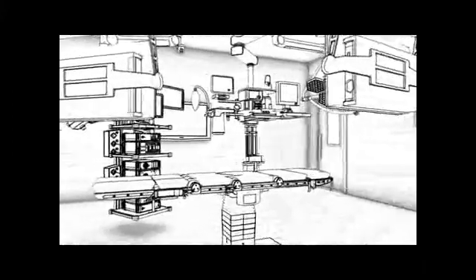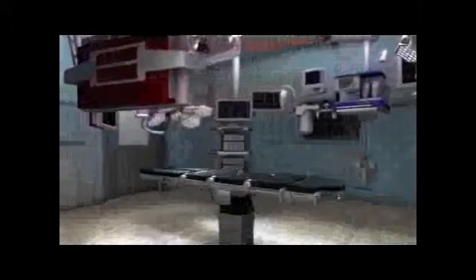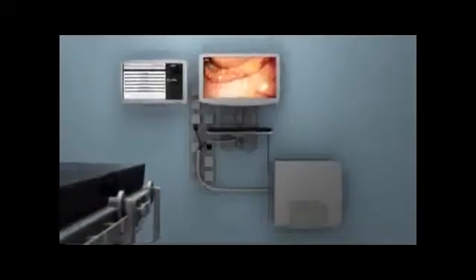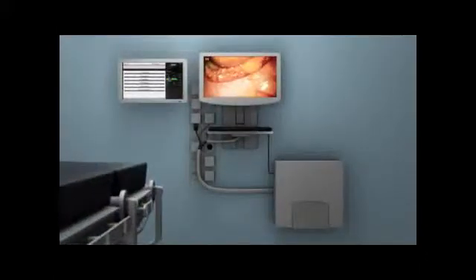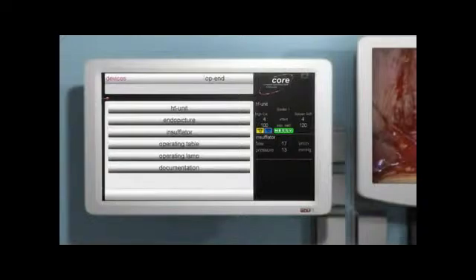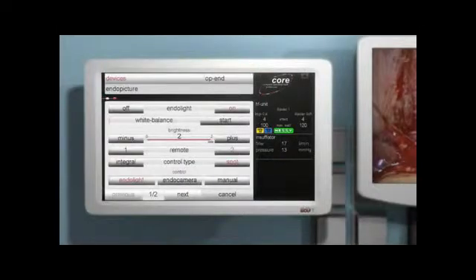However, apart from design and ergonomic aspects, Core is all about integration. Networking all functions and central computer control is a key feature of the Core operating theatre — all equipment is controlled from here. An intuitive user interface allows users to start operating equipment immediately without having to spend a lot of time studying instruction manuals.